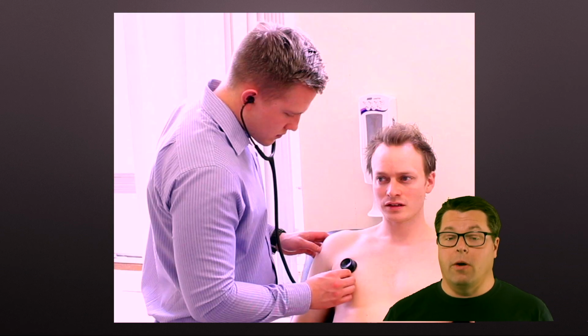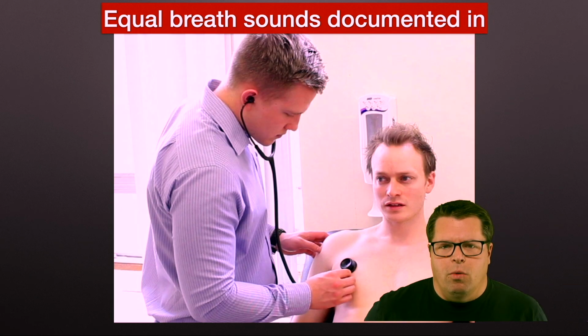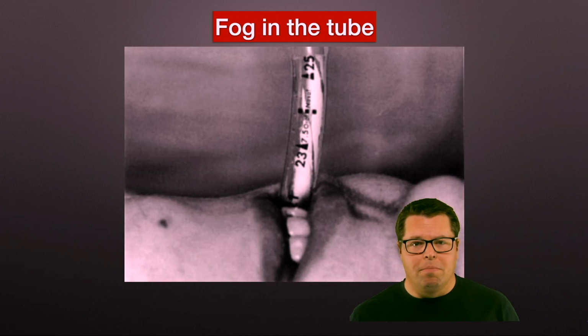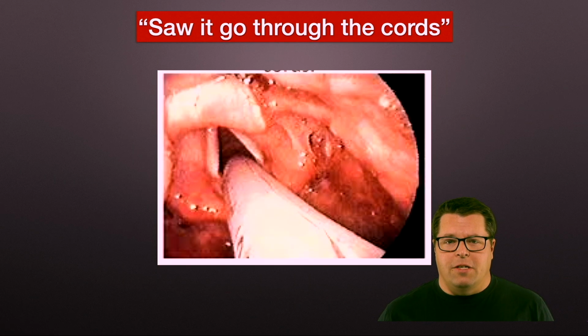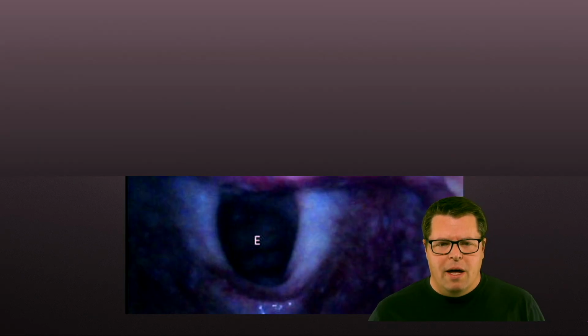Why is it so important? Aren't there other ways of confirming tubes or your advanced airway placement other than just using End Tidal CO2? Well, okay, you might say I documented equal breath sounds. Well, you know what? Equal breath sounds are documented in 95% of misplaced tubes. How about mist in the tube? Fog in the tube was noted in 85% of misplaced tubes. Well, how about I saw the tube go through the cords? In 50% of misplaced tubes, somebody says, I saw it go through the cords. And you may say, well, how in the heck does that happen? Well, here's kind of why.